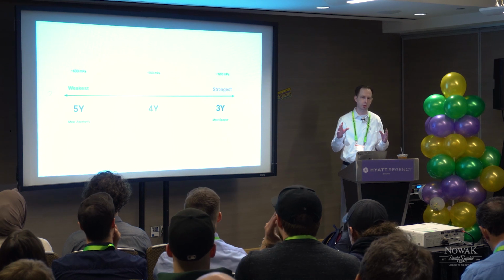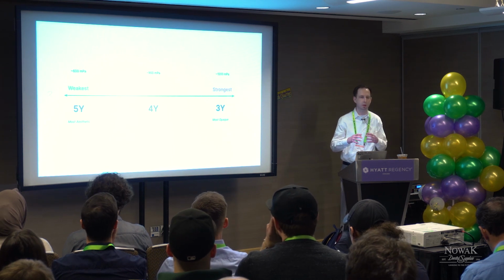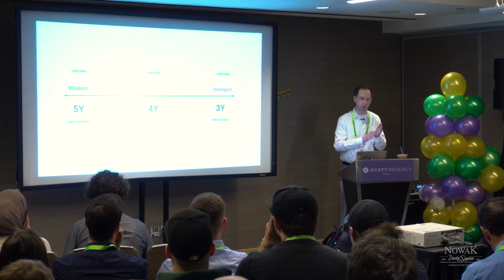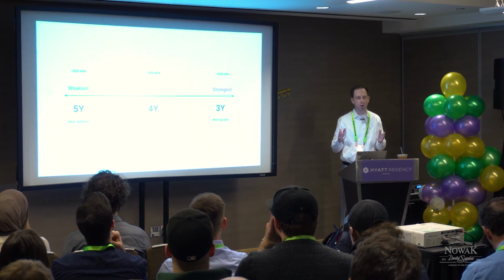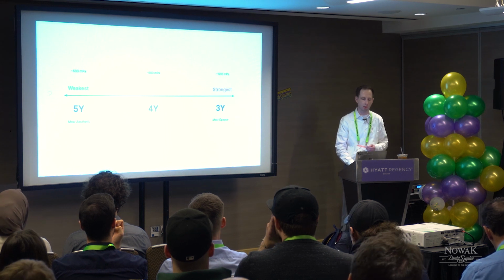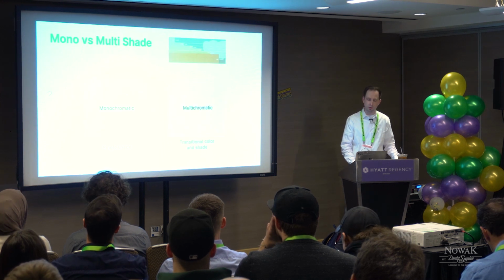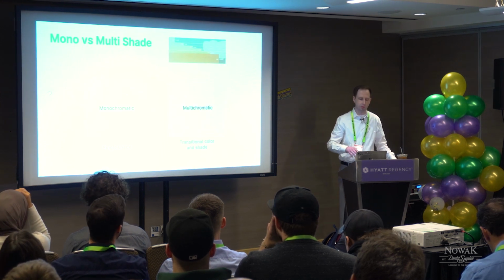when you're looking at materials and when you're setting up a portfolio or trying to simplify or condense down your offerings to your customers, think about what classes of zirconia you want, 3, 4, 5Y, and what strength advantages or disadvantages they have accordingly. And of course, that image should have been gone.